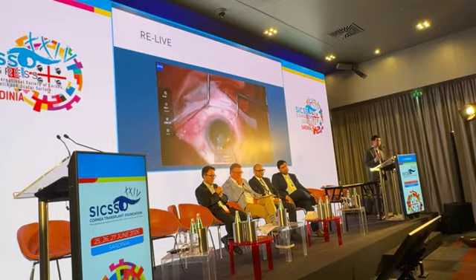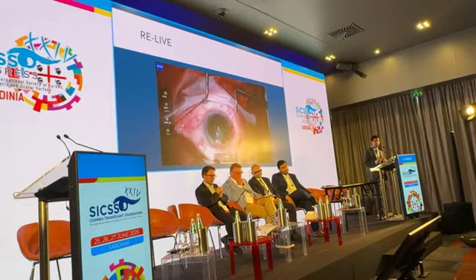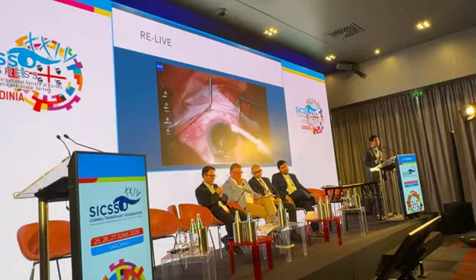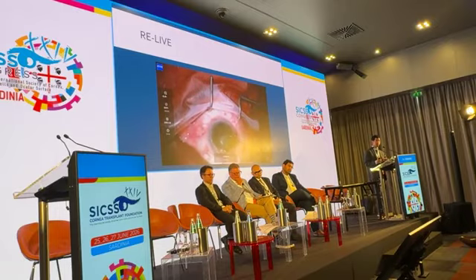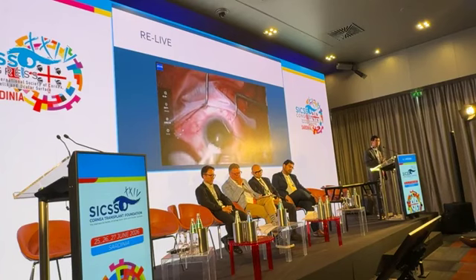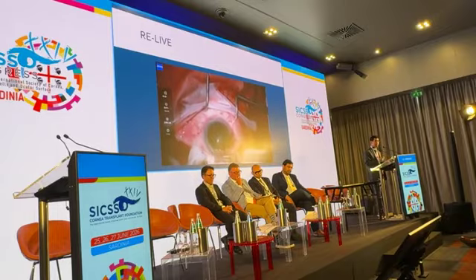And then the goal is to make sure it's in position and then to smooth it. If it's very laterally displaced, you can go underneath with a BSS cannula and just squirt fluid in the interface, and that can move it much more laterally. If you just need to move it a little, larger sweeping motions are adequate, and we'll do that here. Adequate to move it just like a 0.5 millimeter or so.